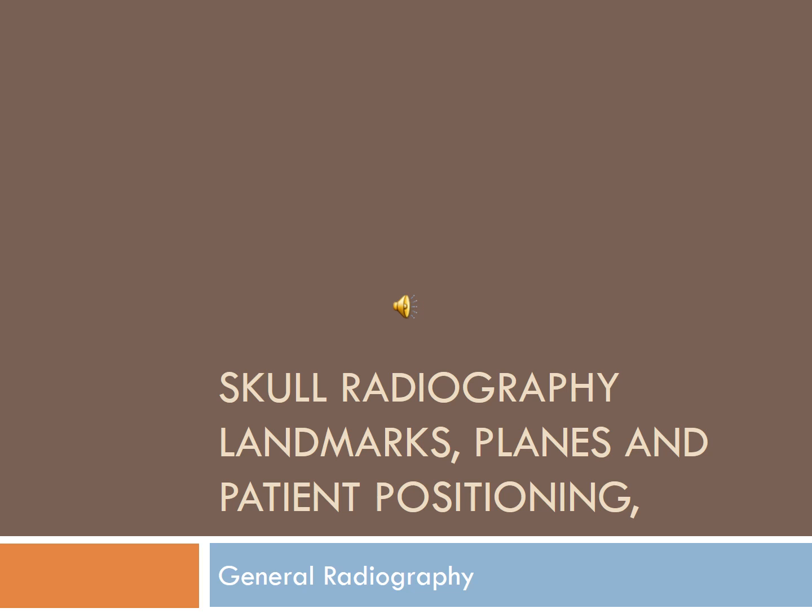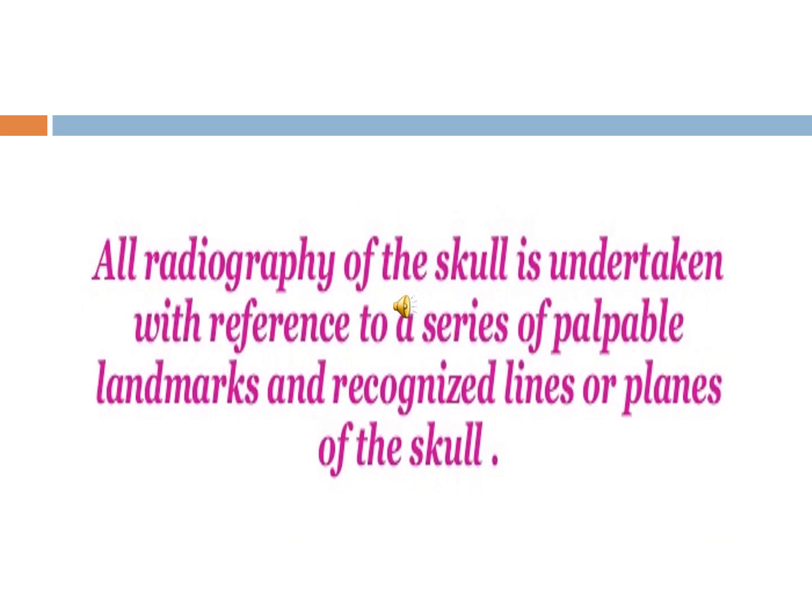In today's lecture, we are going to study landmarks, planes, and patient positioning that are used in skull radiography. All radiography of the skull is undertaken with reference to a series of palpable landmarks and recognized lines or planes of the skull. Proper radiographic positioning of the skull depends on a number of lines and planes as well as palpable or visible landmarks.